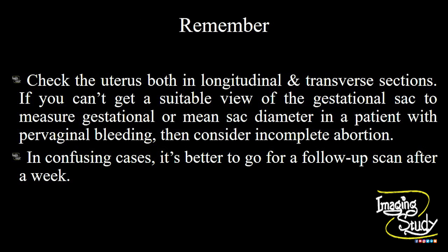Now the take-home message. Check the uterus both in longitudinal and transverse sections. If you can't get a suitable view of the gestational sac to measure the gestational or mean sac diameter in a patient complaining of pervaginal bleeding, then consider incomplete abortion. In confusing cases, it's better to do a follow-up scan after one week to avoid overdiagnosis.